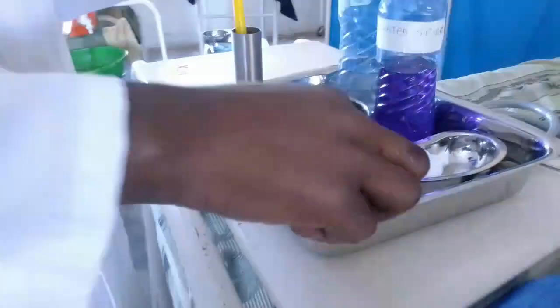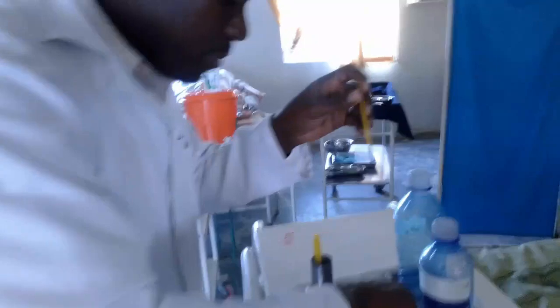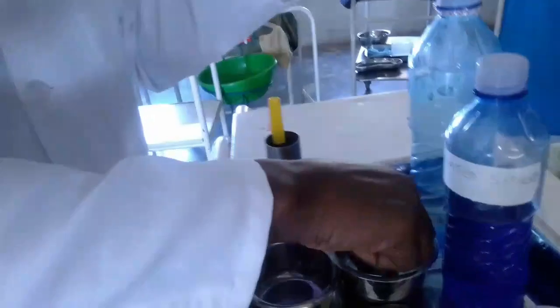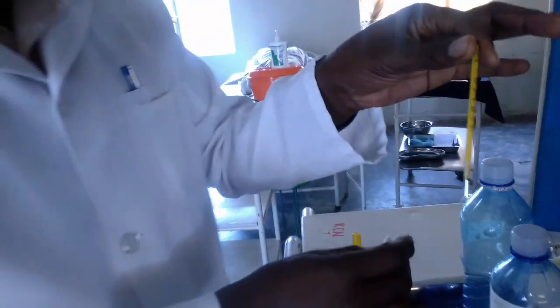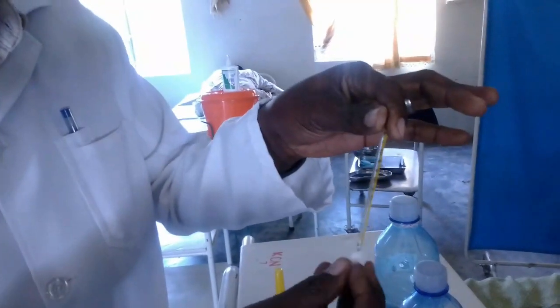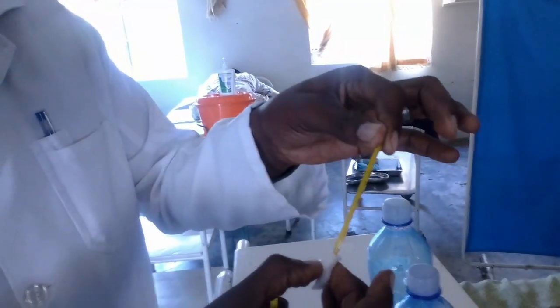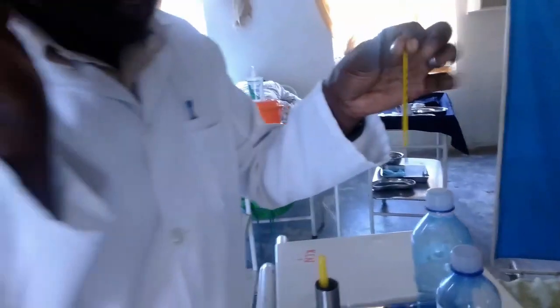Then the first thing that you do is to get a swab. Since you are inserting it into the patient's armpit, you go in cool boiled water. Then the principle still stands: is it cleanest to dirtiest or dirtiest to cleanest? So before use, you have to start from the bulb and go up like that. Then you discard. Then you ask Mr. Sapo to insert it, or you can insert it. So this is how you put it.